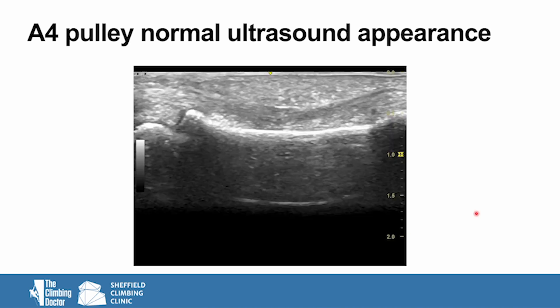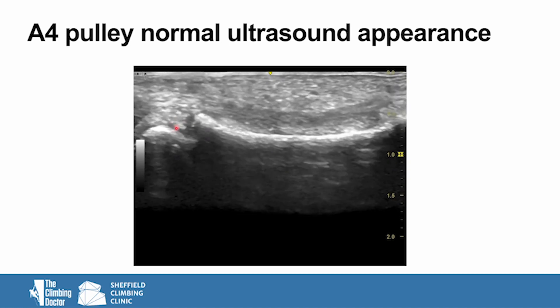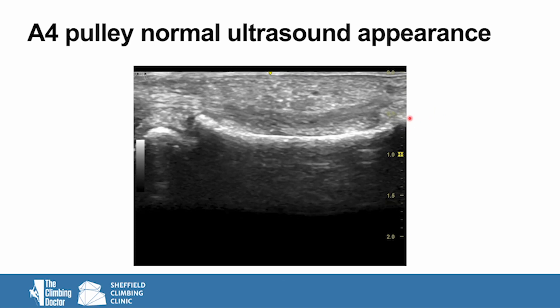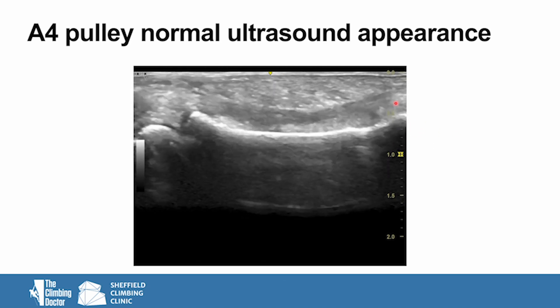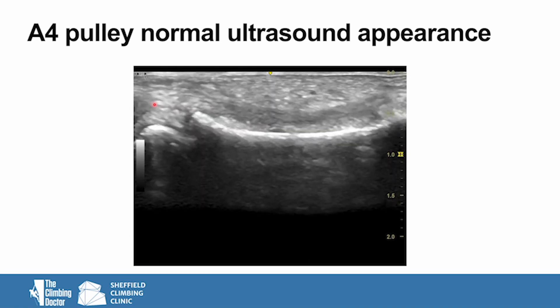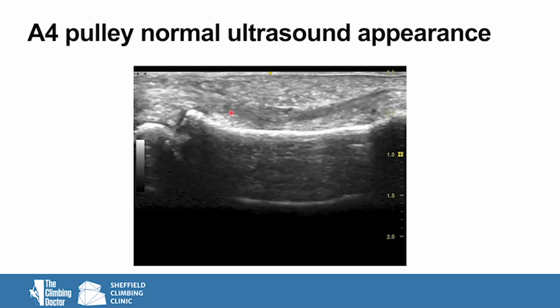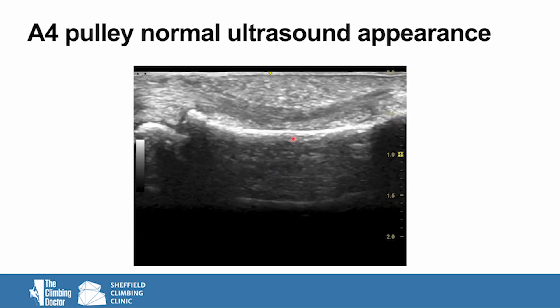Let's look at a moving image of a normal A4 pulley on ultrasound. In this video we can see the proximal interphalangeal joint, the middle phalanx bone, and off screen will be the distal interphalangeal joint. The patient is flexing and extending their fingertip and we can see the flexor tendons moving with no gap or problem between the flexor tendons and the bone.